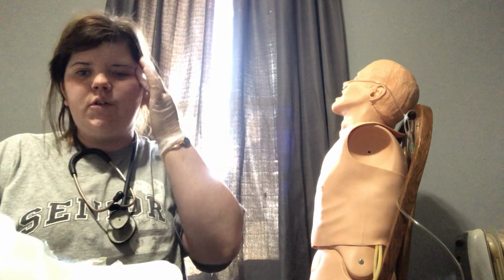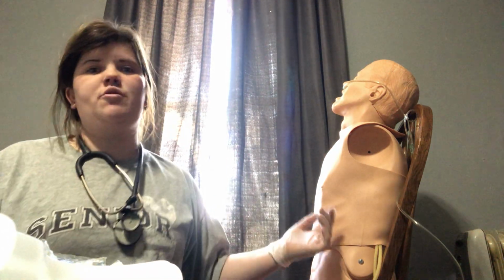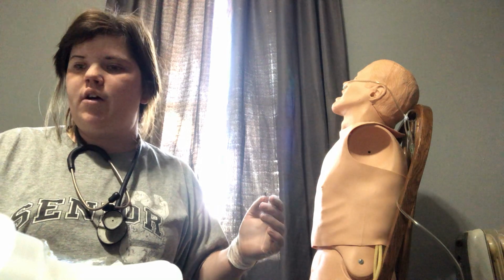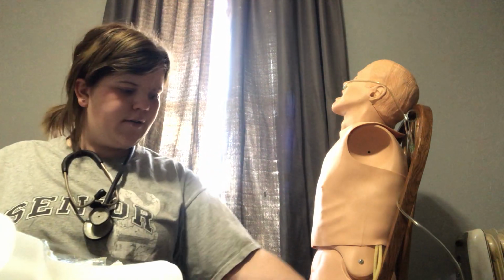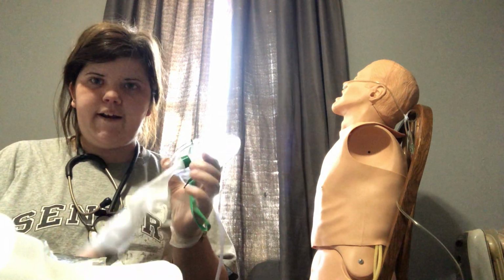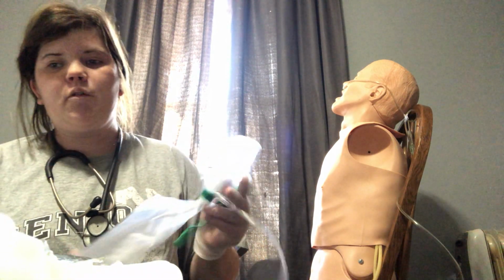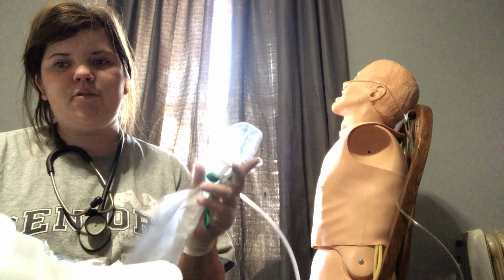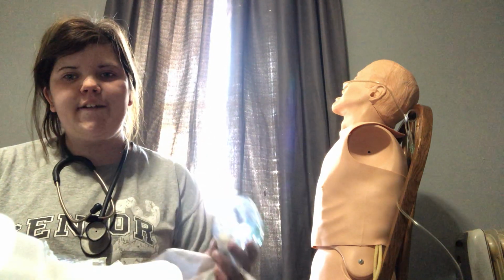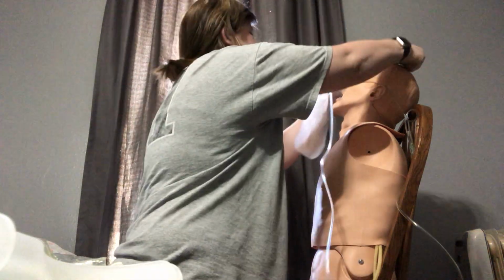We are going to then realize that based on our new vital signs that maybe we need to do a non-rebreather. So we're going to get our non-rebreather. I'm going to inflate the bag, hook it up and inflate the bag. We're going to have it set at, we'll say 15 liters per minute. So it's between 10 and 15 for a non-rebreather. The reservoir is inflated. We're going to just go ahead and throw it over the top.